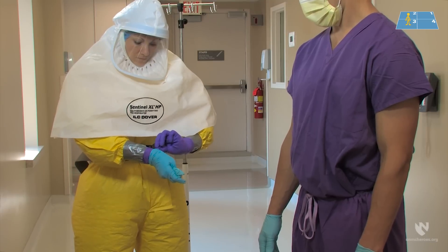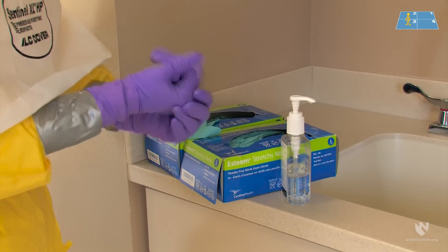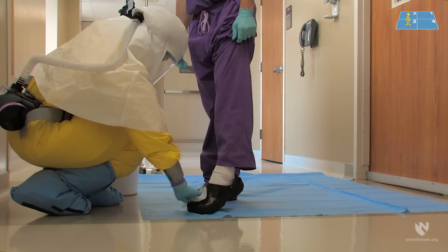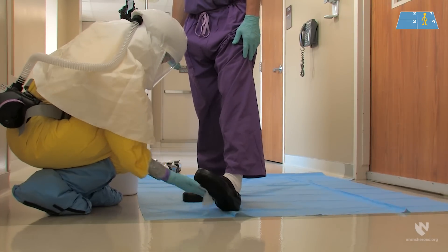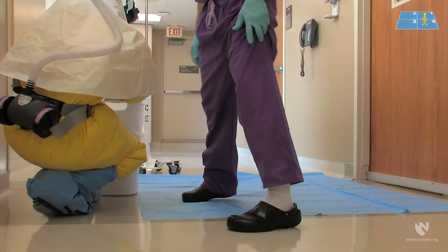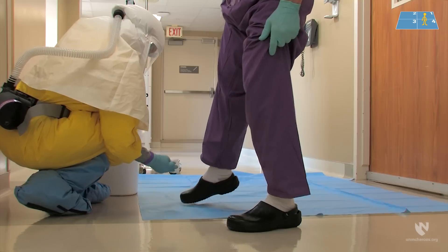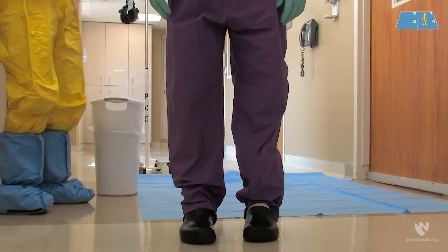The doffing partner will remove patient care gloves using glove-in-glove technique and dispose of them gently in the trash. The doffing partner then performs hand hygiene and applies a clean pair of gloves. The doffing partner will then clean the healthcare worker's plastic footwear with a bleach wipe, starting with the top and then the bottom. The healthcare worker can then place their clean foot on the floor outside the doffing pad, and the same technique is used for the other foot.